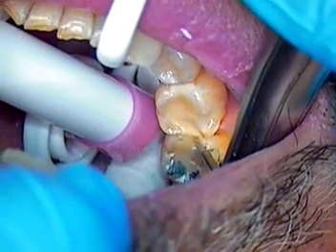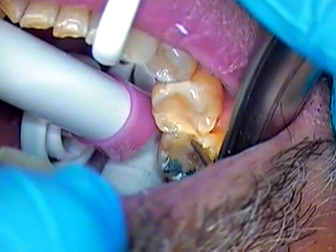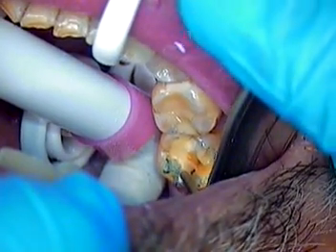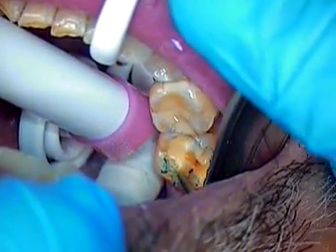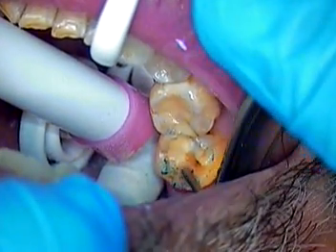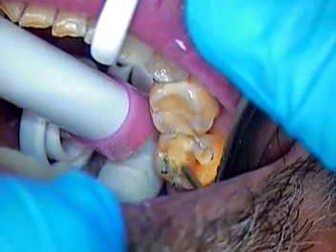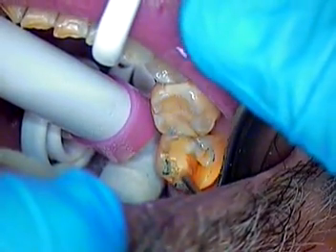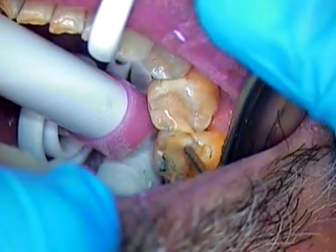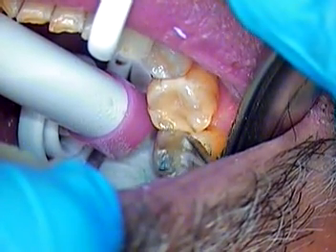So first things first, depth cuts come on the buccal side. For all the students out there and also young dentists who are learning to prep these, I would just highly advise doing depth cuts first. This tooth's already been built up. We did utilize the rubber dam in our last procedure. Now we're just going to go ahead and video this. So the buccal cusp reduction first. We did have to reduce a little of the opposing to gain a little extra room for occlusal anatomy.